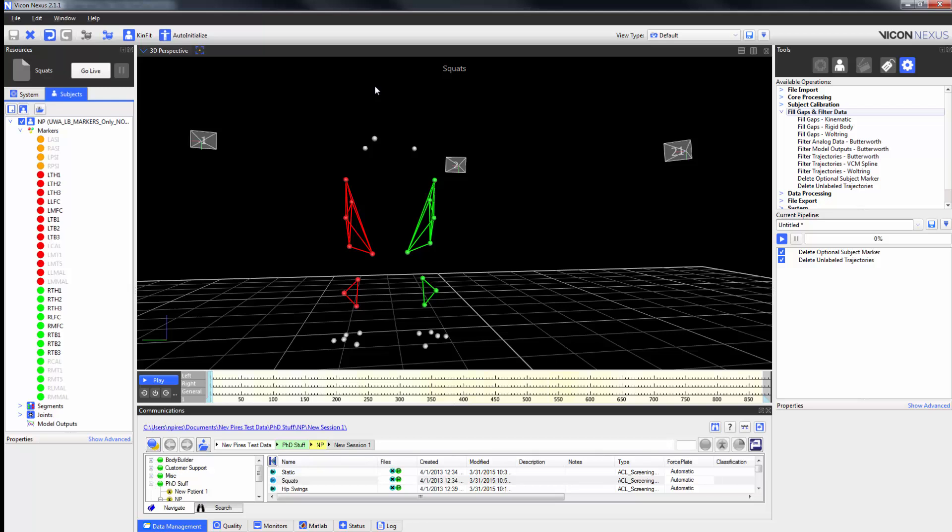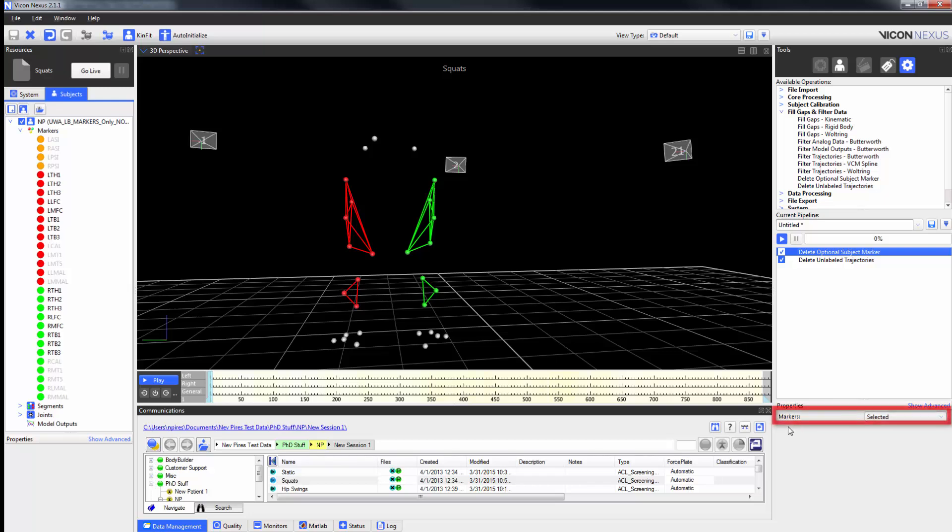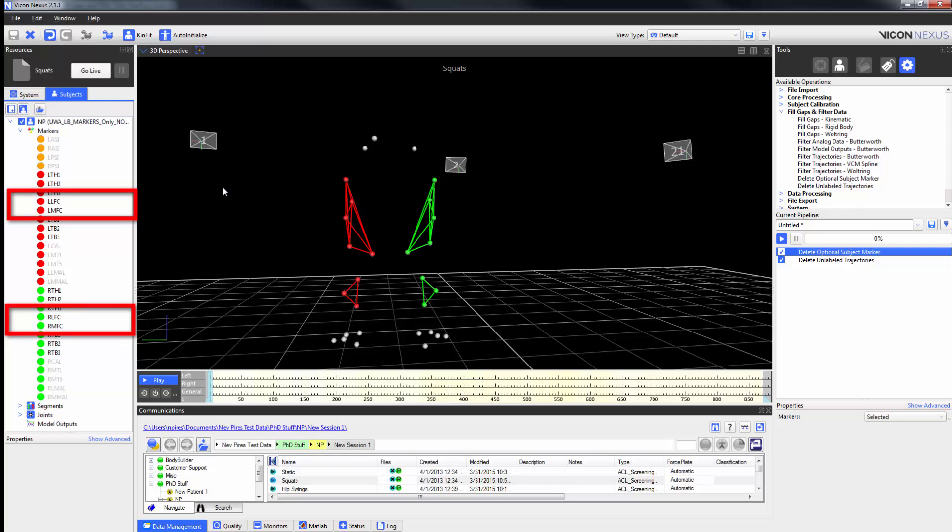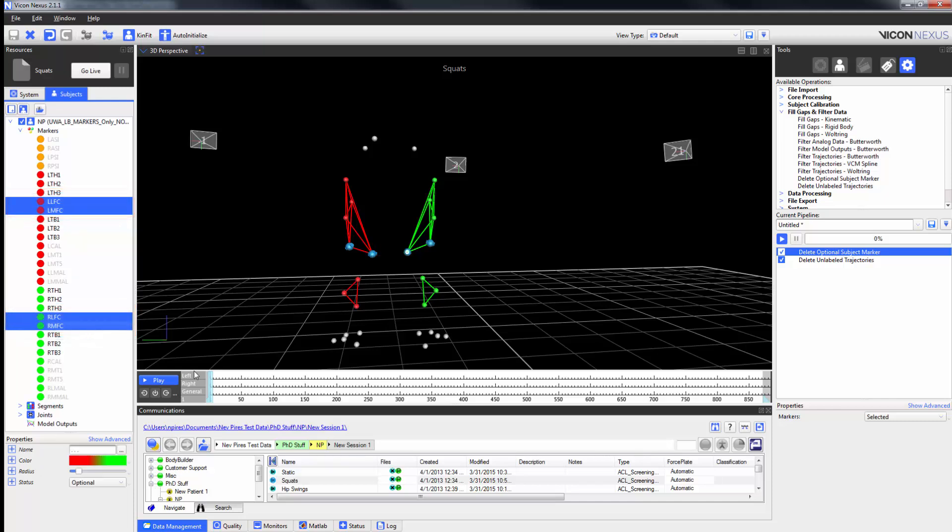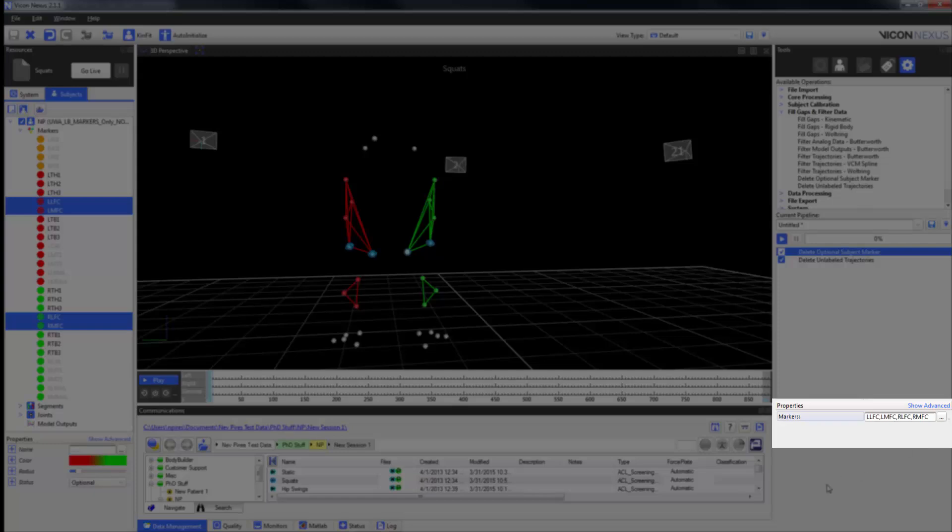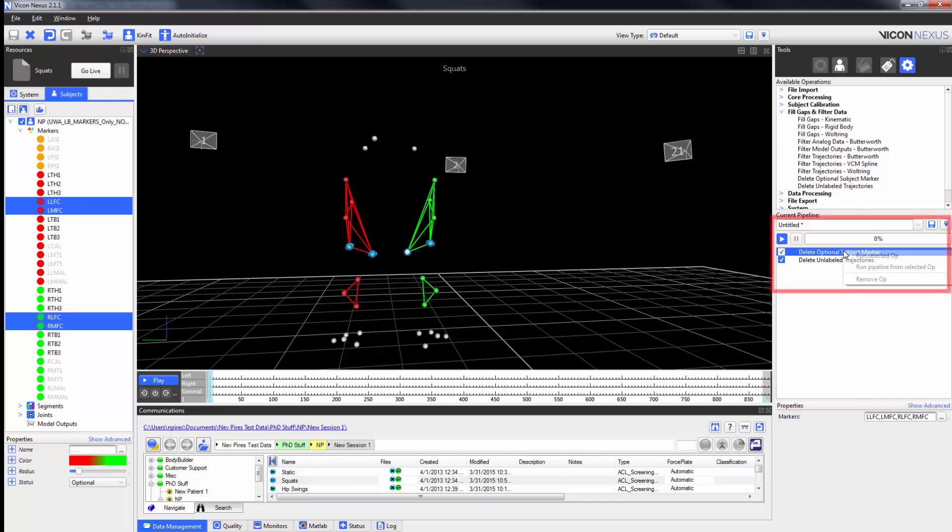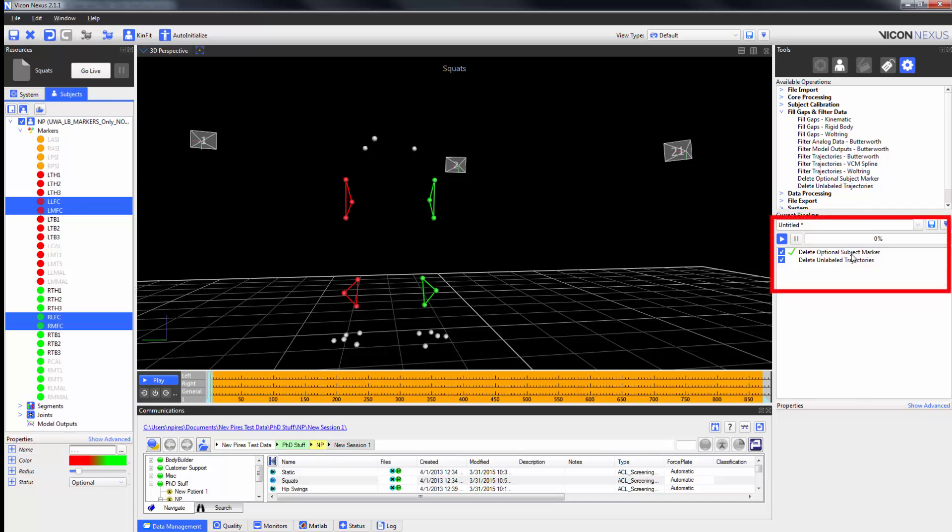The final two pipeline operations that we are going to be talking about today are the Delete Optional Subject Marker and Delete Unlabeled Trajectories Pipeline Operations. In order to use the Delete Optional Subject Marker operation, we first need to select our optional markers. In this case here, they are my left and right lateral and medial femoral condyles respectively. In my properties for these markers, we can see that they are set to optional. As with other pipeline operations, I can turn the macro off to keep these names consistent for future reference. Running the selected operation will delete those markers.